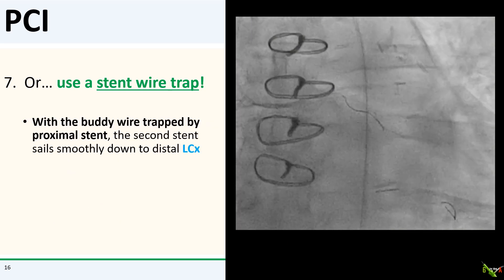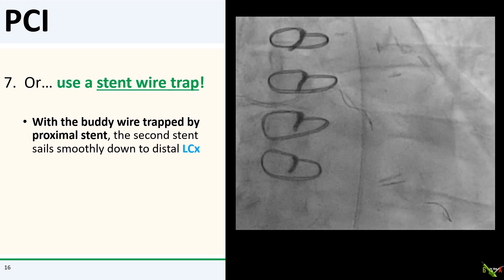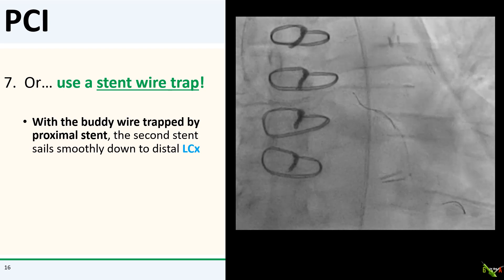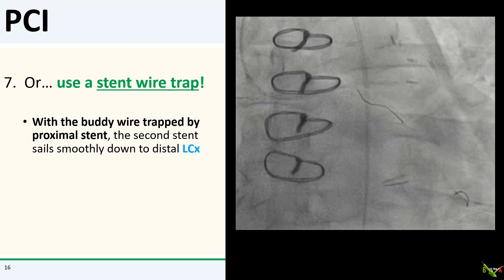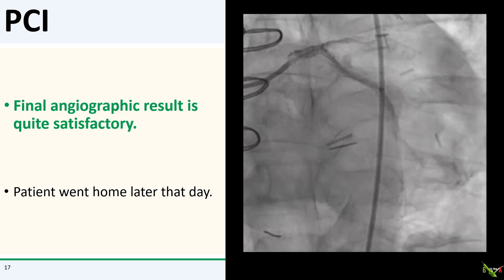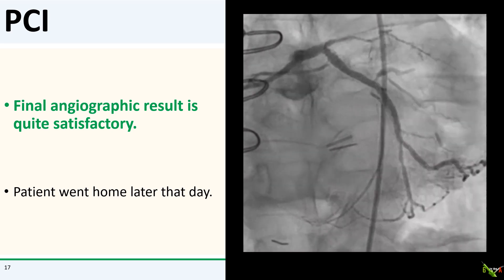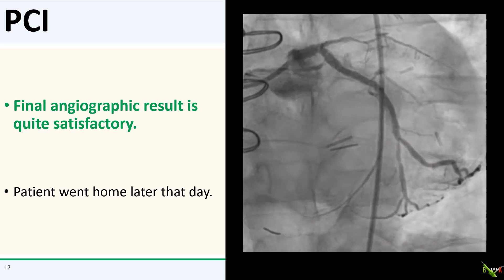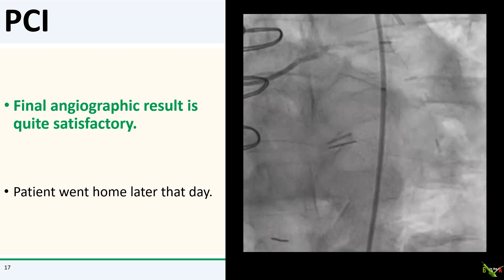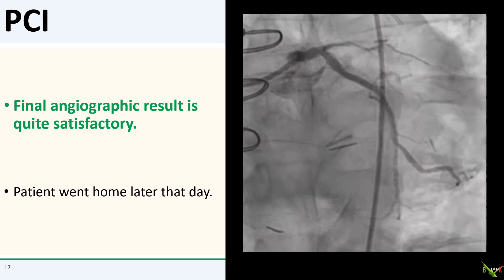All right, so now with the buddy wire trapped by the proximal stent, you can see that the second stent sailed very easily down to its proper position in the distal circumflex. Here is the final angiographic result, which we thought was quite satisfactory. The patient did very well and went home later that day.